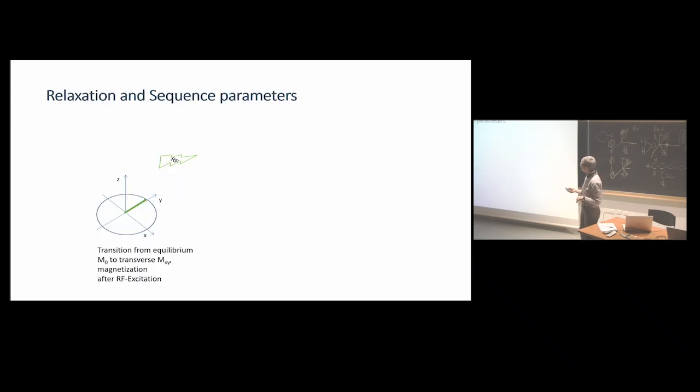So let's go to another representation of this net magnetization. This is our rotating frame representation that we were just introduced to. You see here, in principle, after the RF pulse, we can actually start observing the magnetization, because we have magnetization in the transverse plane. So we have XY magnetization. It's no longer longitudinal. Longitudinal meaning that it's fixed in some of its energy level. Well, virtually fixed, net magnetization at least.